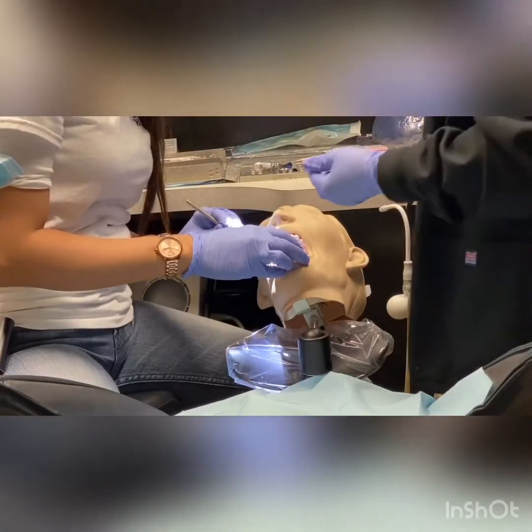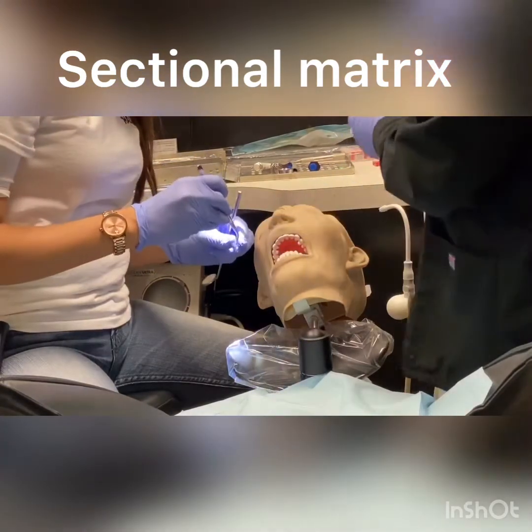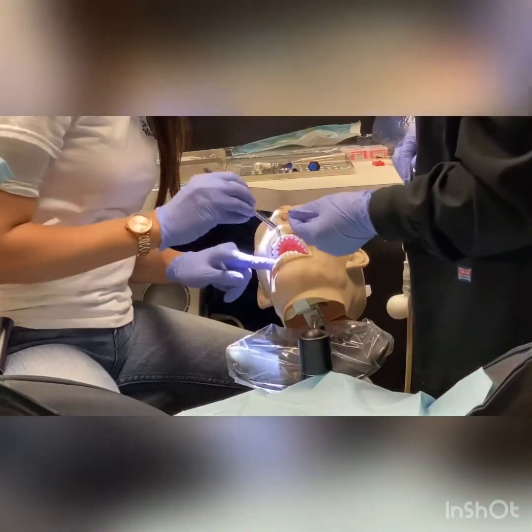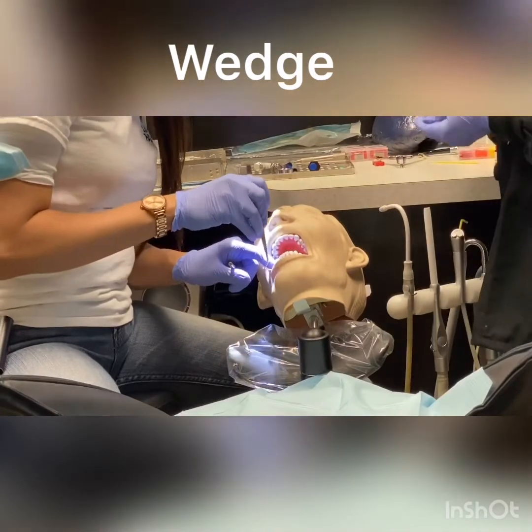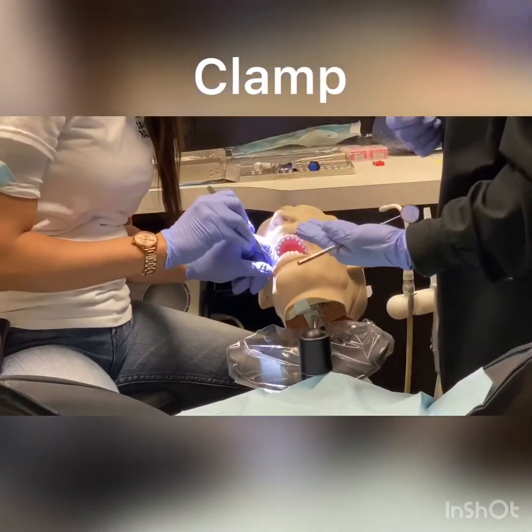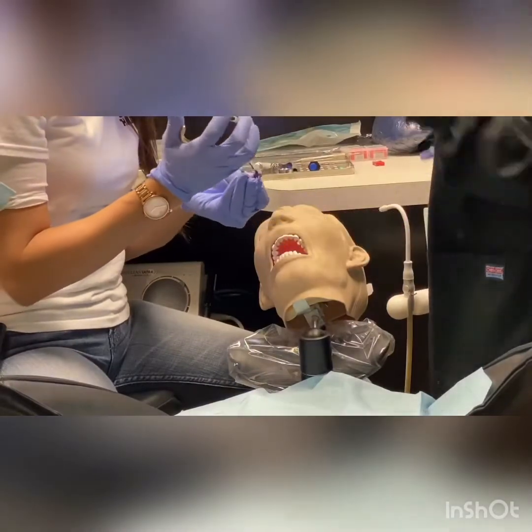Since we're going to fill it up, we're going to start with the matrix here, and I'm going to hand her the cotton plier so she can pick it up. Then you'll have your wedge ready to go. So once she's done placing it, she can grab her wedge, and then you'll want to pick up the ring and the forceps.